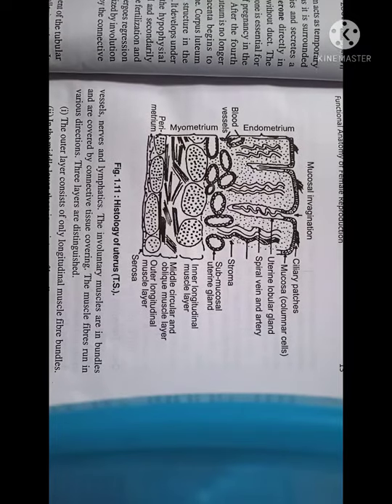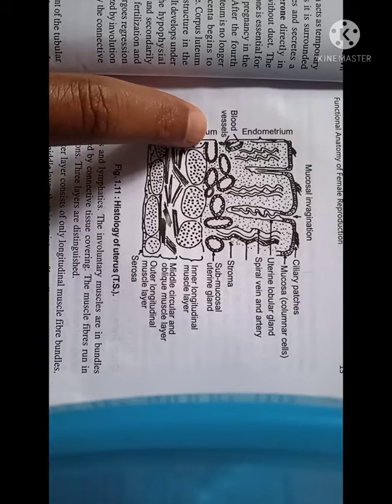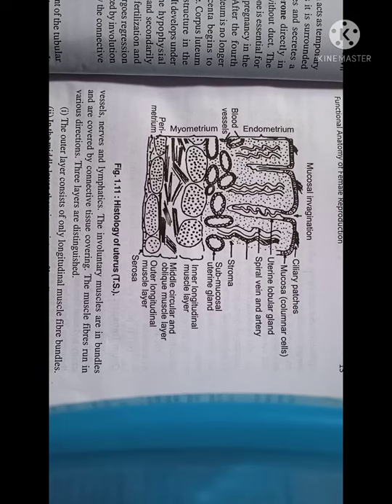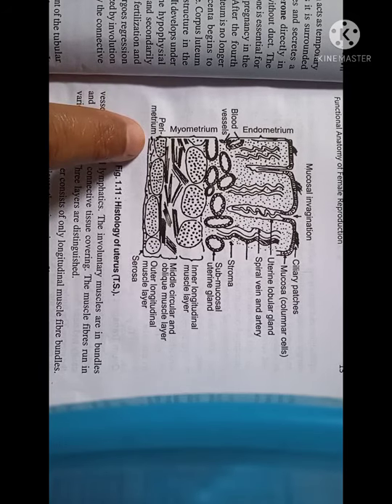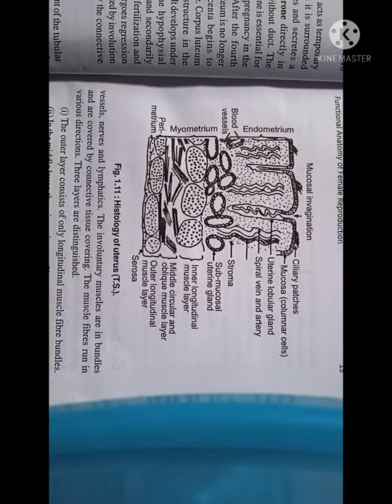Now we study the different layers of the uterus. The uterus is differentiated histologically into three layers. You see here, it differentiates into three layers: perimetrium, myometrium, and endometrium. The perimetrium is the outermost layer, the middle is the myometrium layer, and the inner is the endometrium layer.